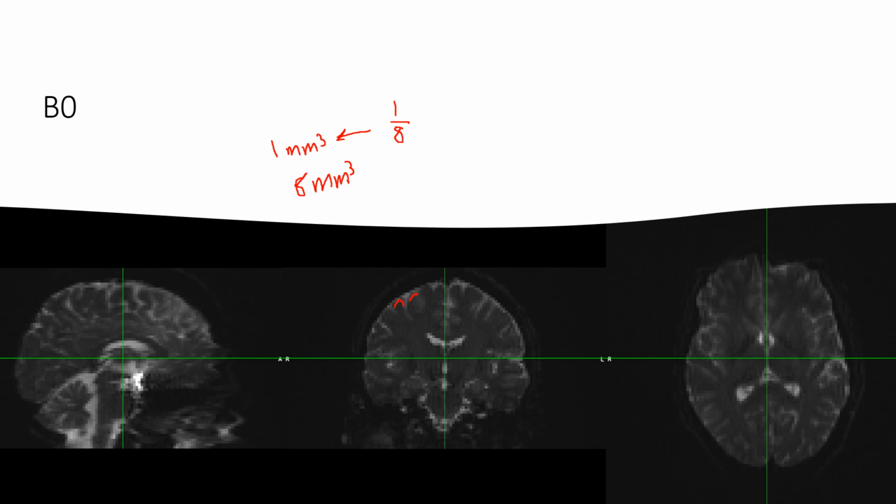And the problem with that is with really low signal to noise, then you have to acquire more directions. So instead of 64, maybe we need to acquire 200 directions. That just takes a long time in the scanner. And so we'll typically do a trade-off and do a 2mm voxel, sometimes a little bit higher resolution if you have a little bit more time for this. But a B0 image has no diffusion weighting, and we'll look at that.